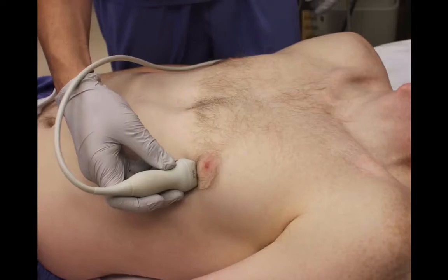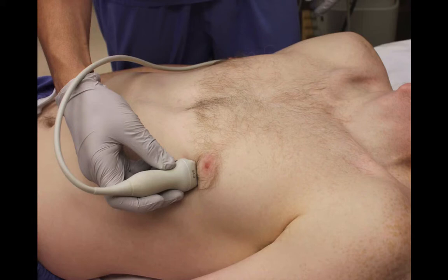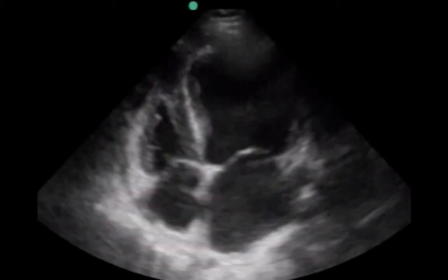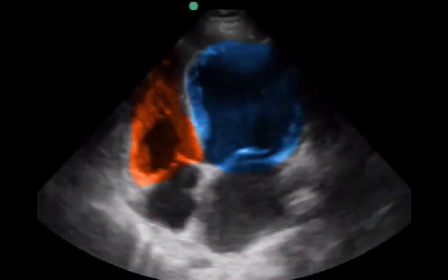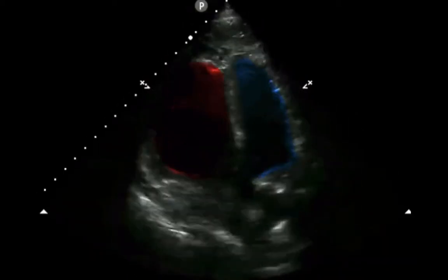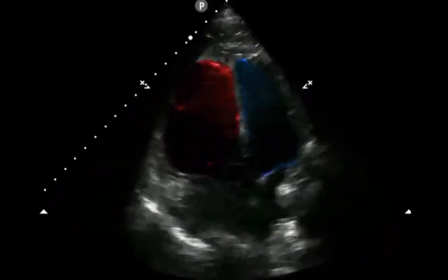Now I saved the best view for right heart strain for last. You stick your probe at the point of maximal impulse at the apex of the heart with the probe marker facing towards the patient's right, and you should get an image like this. You want to look at the ratios between the left ventricle and the right ventricle. The left ventricle is the blue and the right ventricle is the red. Notice how the left ventricle is much bigger than the right ventricle — this is a good ratio. Now compare that to this image, where the left ventricle or blue chamber is much smaller than the right ventricle or red chamber.